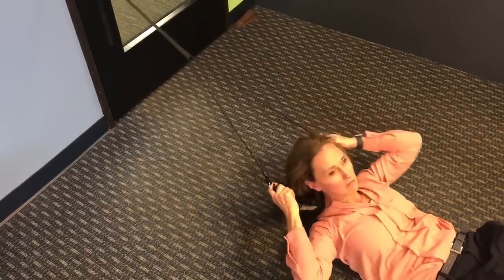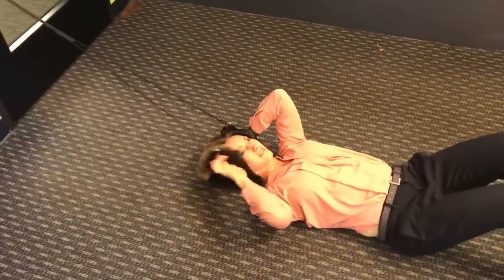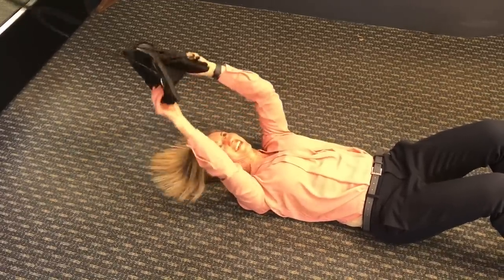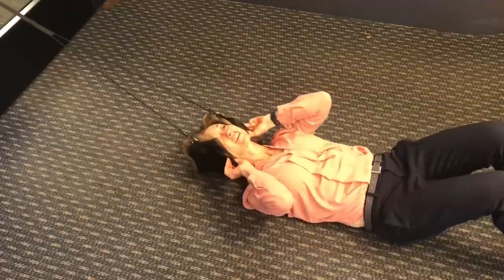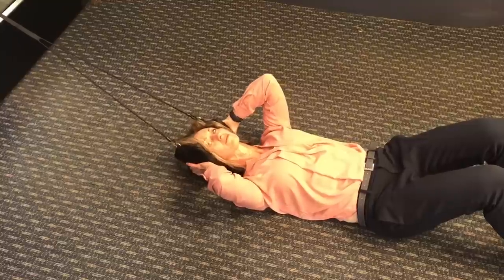My wife is going to demonstrate this. She had the idea that maybe it would still work if we pulled it away, but you can see if you apply it and start to pull away, at the risk of bumping her head back into the door, it starts to pull away. She understands the concept of how this is supposed to traction, but not every patient is going to grab that and understand. In the picture, it does not show the lady holding her head there, and she is actually touching the ground — her head is not elevated in any way.